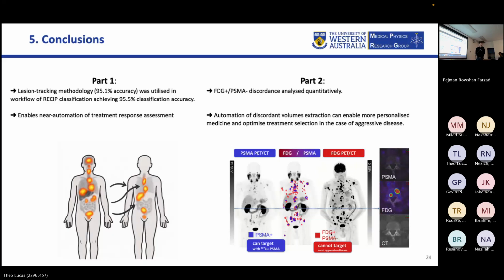So for small lesions really close to each other, the algorithm won't do much to dilate the lesion, and the source of error will come from the registration because it's so tiny. Yes, that's quite likely, a mismatch during the registration. Okay, thank you.